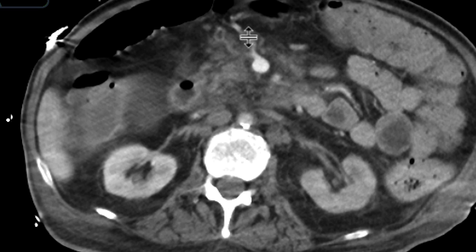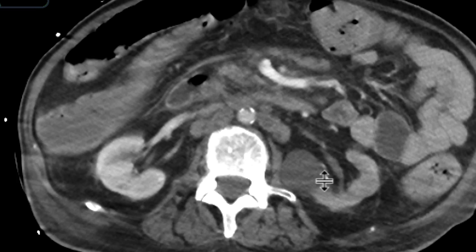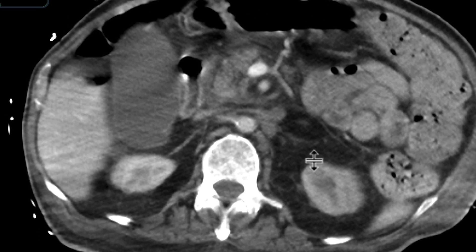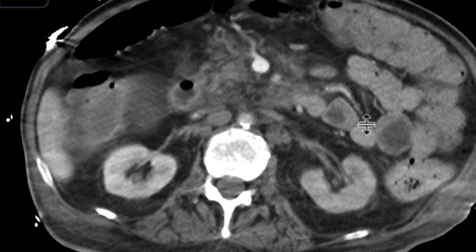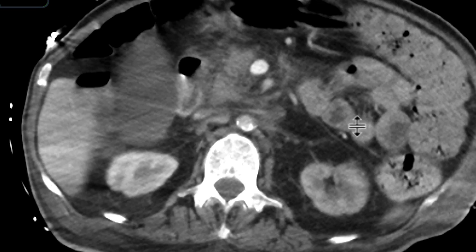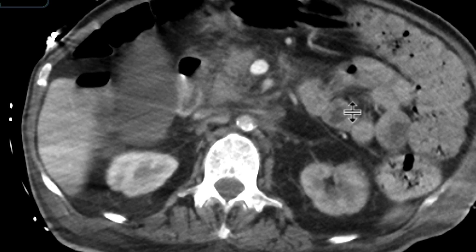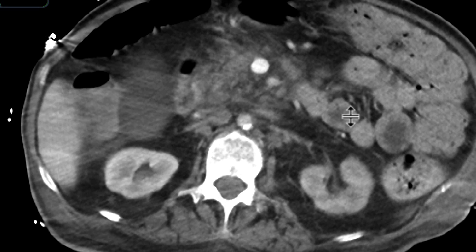We can see that there's a lot of adenopathy here. The left renal vein is probably okay — we can see that it's diminished in caliber, but it does cross over reasonably well. However, the left renal artery, if we look at it very closely right at its takeoff in the aorta, we can see that there's a lot of thrombus there. In fact, you don't even see a patent lumen at that level.